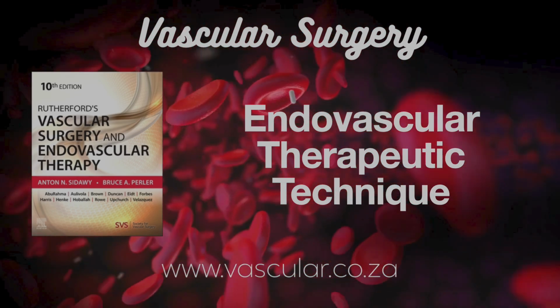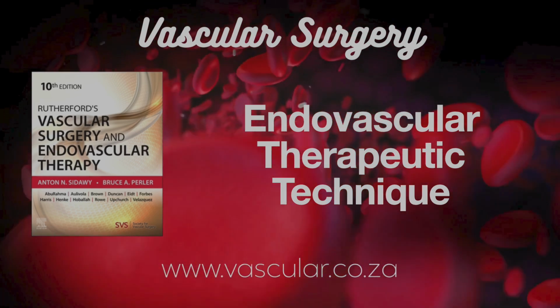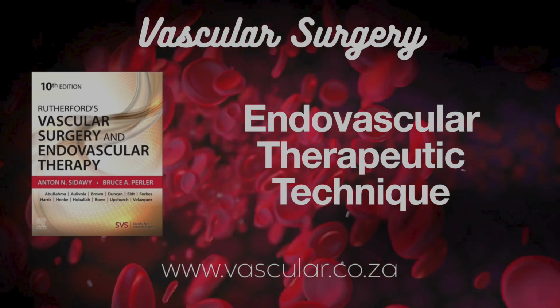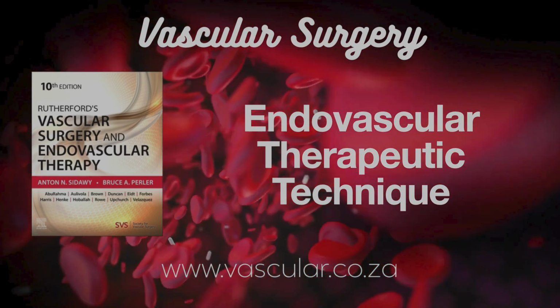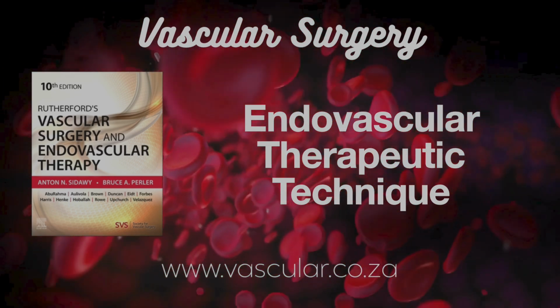Does it damage the healthy vessel wall? The principle is differential cutting. It preferentially tackles the hard, inelastic calcium, but tends to deflect off the softer, elastic normal wall. Great for prepping really calcified lesions before balloons or stents.